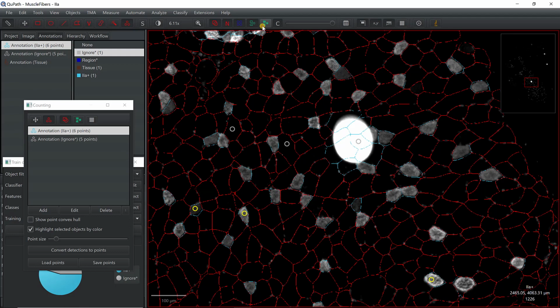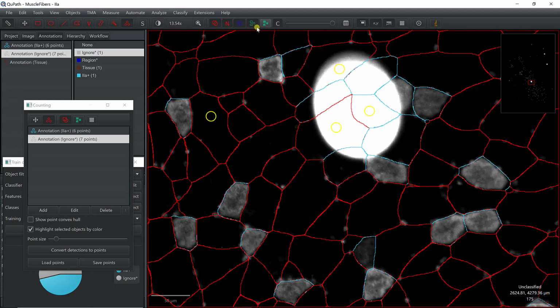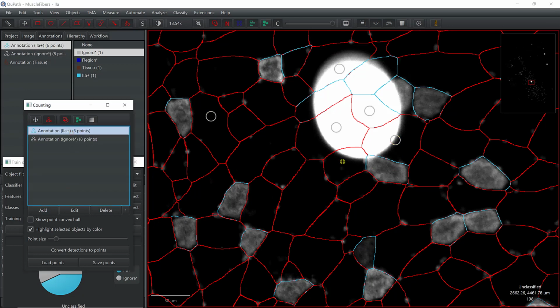So you can do that to see which ones are positive, which ones are negative. As you can see here, just giving a new positive example helps the classifier to segregate which is positive from which is negative. So here it doesn't work. I'm going to try to add another example as negative. Let's say this one, and you see it starts to be able to find them. So I'm going to say that this is negative, all right, and that works, while this is positive and this is positive.